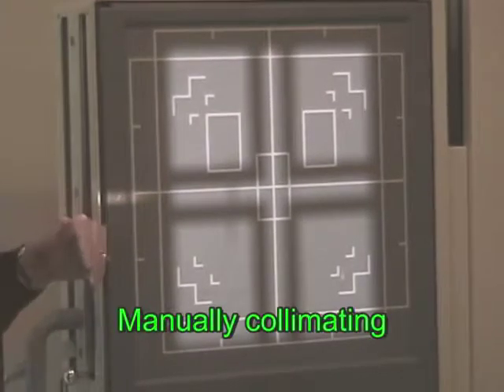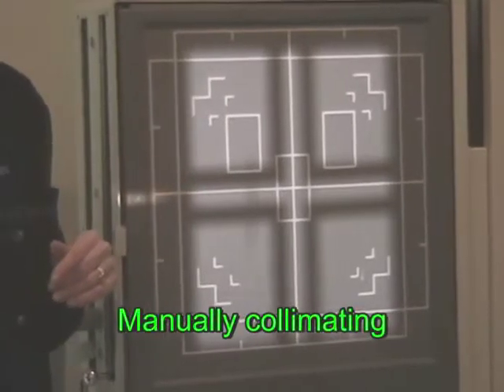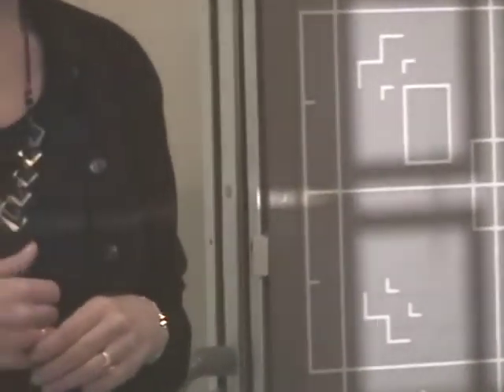This is manually collimating to your field size. Most hospitals have automatic collimation. As soon as you put the cassette in the bucky tray, the collimator shutters come down on their own. That's hospital work. Many clinics, private doctors, they will not have the automatic collimation. It's about $10,000 extra on the tube unit.